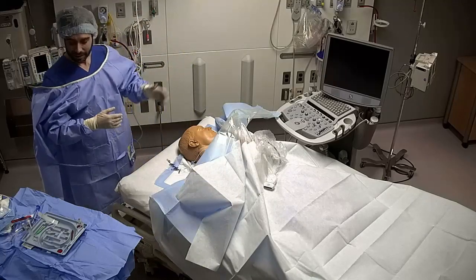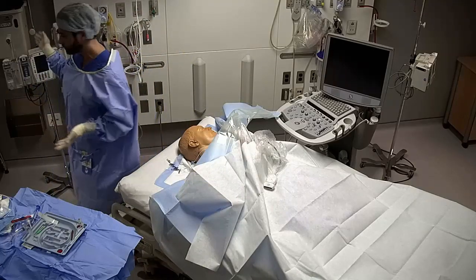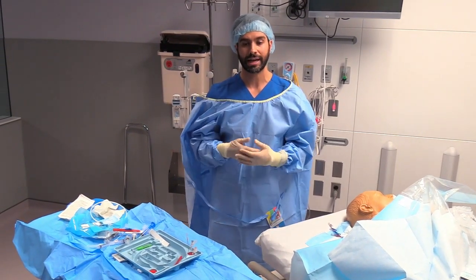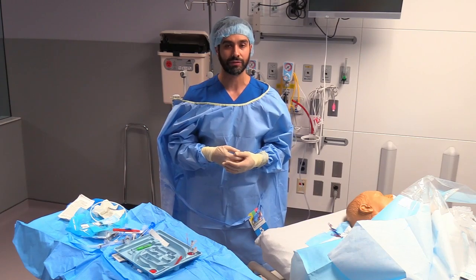After you've removed that, now you're going to take all of your sharps that you have here to your sharps container, throw away all the sharps that you have, and then order a chest x-ray and ask the nurse to go ahead and call for stat chest x-ray to confirm placement.